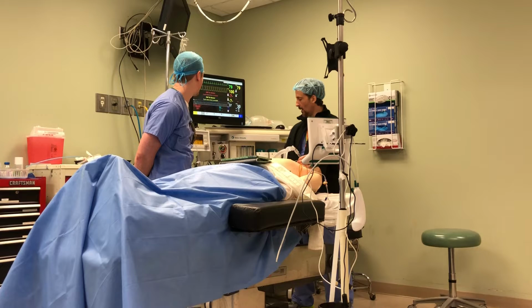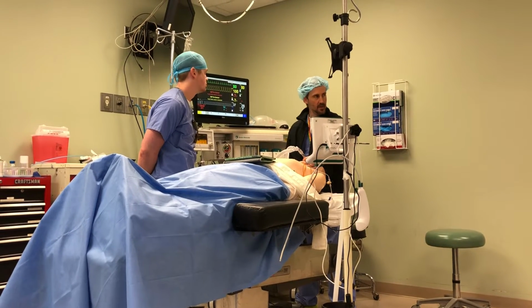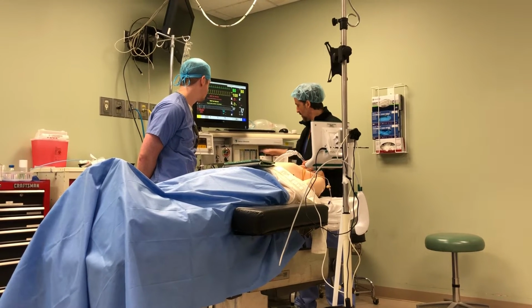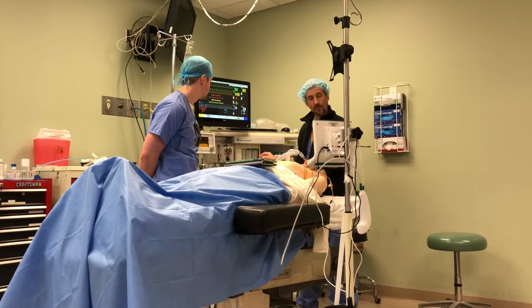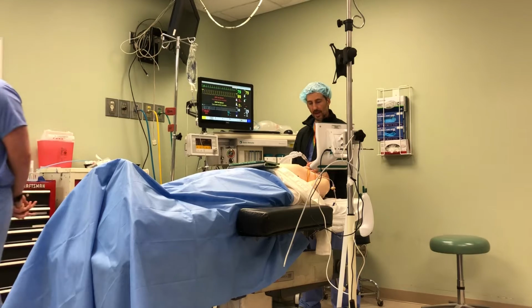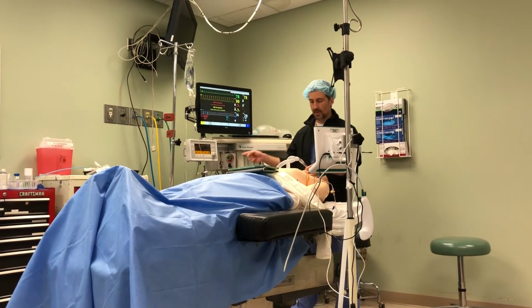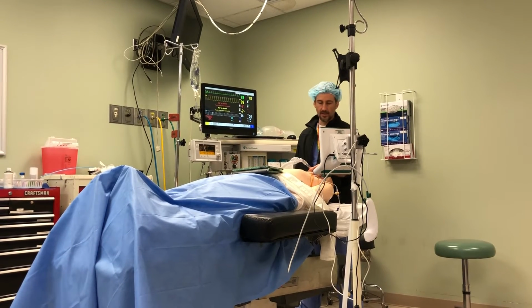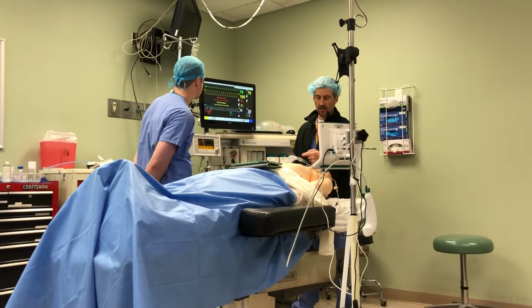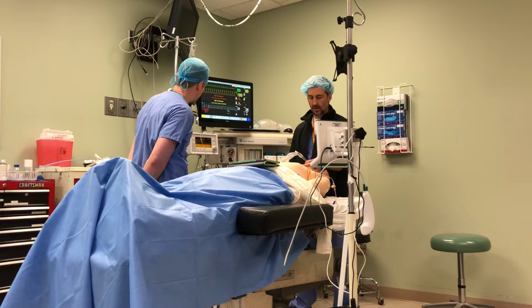Want to make sure that my pressures do not go above 20, again, because you don't want to compromise the sphincter and fill his belly with air. Once I got that, get my agent on, and then you have to verbalize. I'm either going to continue to manually bag him, or I'm going to flip him over to the ventilator, PSV Pro. You have to mention ventilator, PSV Pro. Again, with this, same thing we've done in the O2 sequences. You want to see chest rise. You want to see condensation here in the circuit, and the LMA in the circuit, and positive end tidal CO2, which lets me know I've got a good seal.